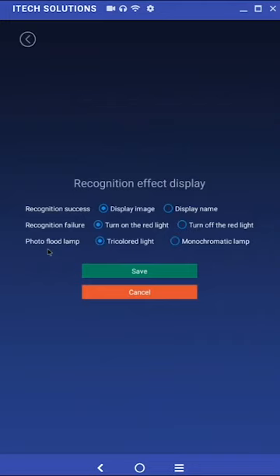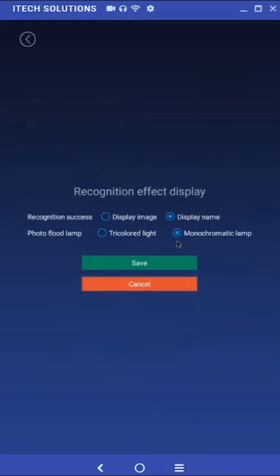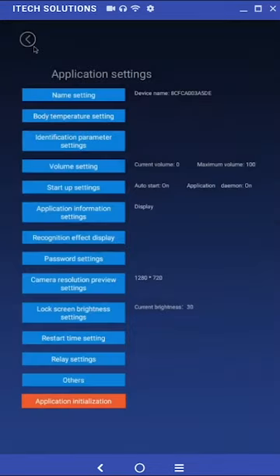Changing the recognition failure option to turn off the red light will not display a red light when the user fails to check-in whether they have a temperature that exceeds the threshold or if they are a stranger. Lastly is the photo flood lamp which refers to the type of light connected to the device. This value will be tri-colored light. However, if it were to be changed to monochromatic lamp then the green and red light will no longer be displayed, disabling the visual cue of a successful or failed check-in.